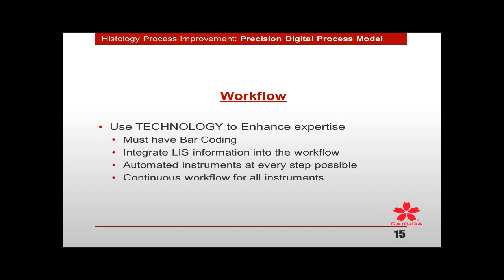And then you need a continuous workflow, because if you haven't set up a continuous workflow, then you're not going to be able to move to small batch. And if you're not going to be able to move to small batch, then you're going to have to figure out how you integrate digital pathology into your system in this large batch mode.